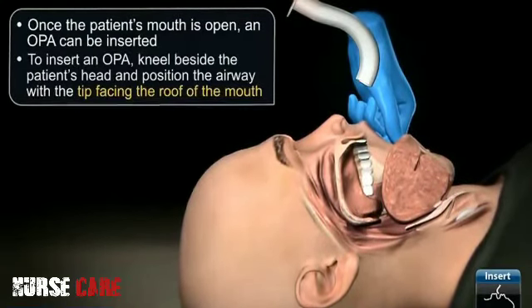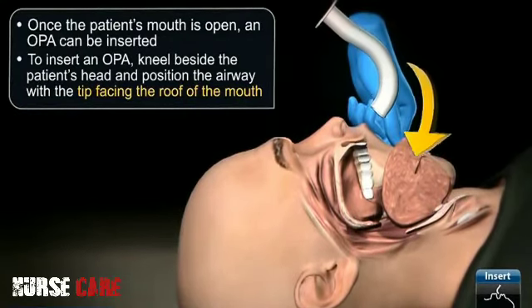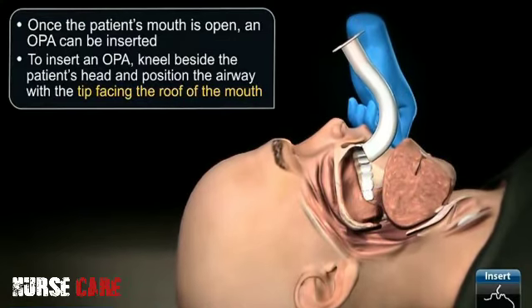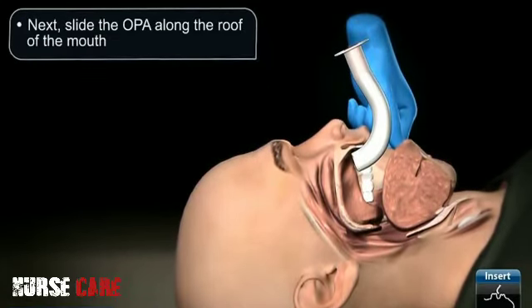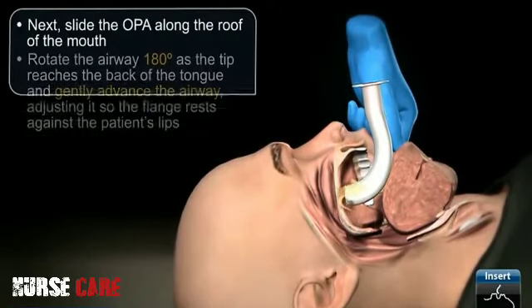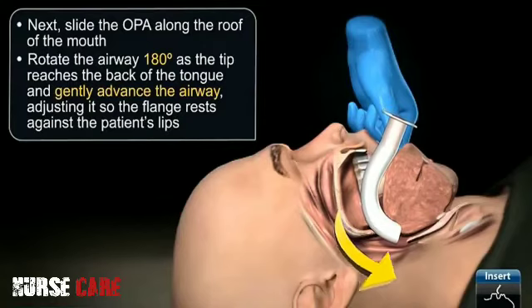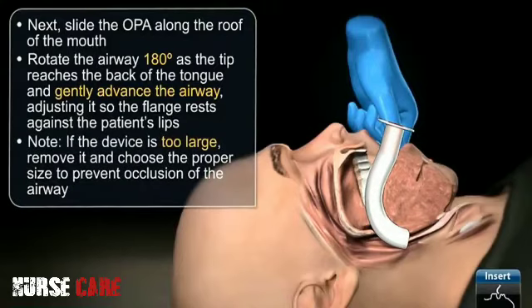To insert an OPA, kneel beside the patient's head and position the airway with the tip facing the roof of the mouth. Next, slide the OPA along the roof of the mouth. Rotate the airway 180 degrees as the tip reaches the back of the tongue, and gently advance the airway, adjusting it so that the flange rests against the patient's lips. Note, if the device is too large, remove it and choose the proper size to prevent occlusion of the airway.